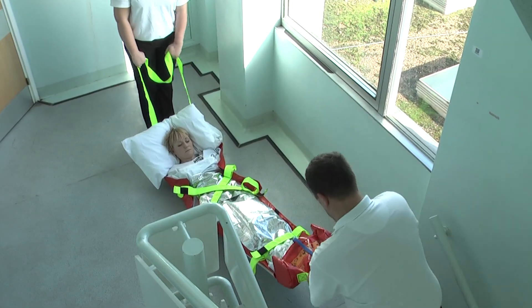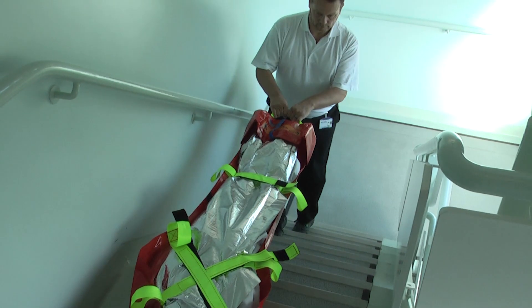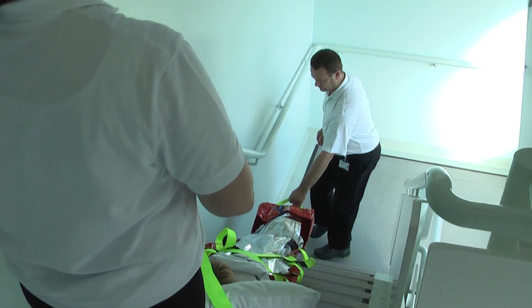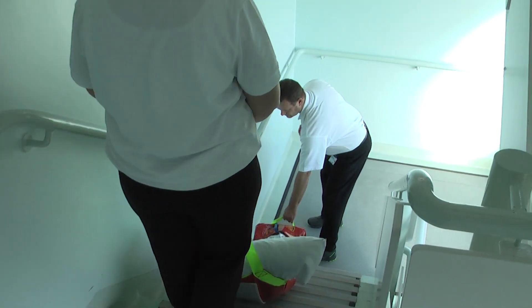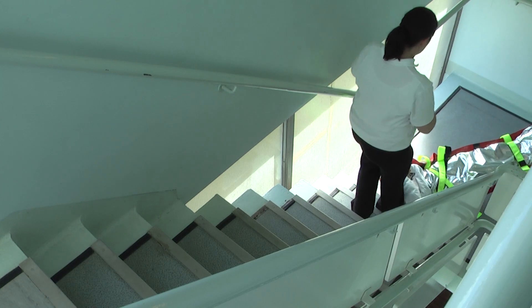With one person at each end of the ALBAC mat the user can be securely moved down the stairs. It is very important that the person at the foot end keeps the ALBAC mat as straight as possible until the upper part of the body has come over the top step. This helps to prevent excessive bending of the user's hip and pelvic area. Once the weight ratio changes, let the foot end come into contact with the stairs. The operator at the head end should keep the pulling strap long and assist by slightly raising the handle as the body moves over the top step.